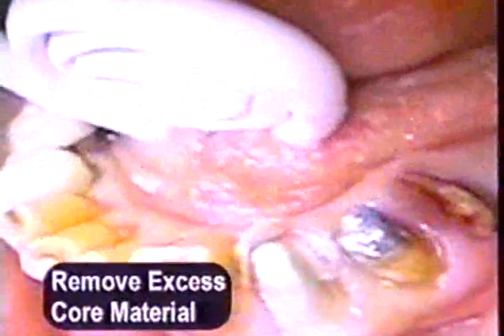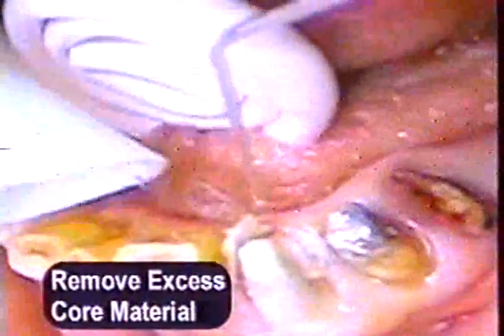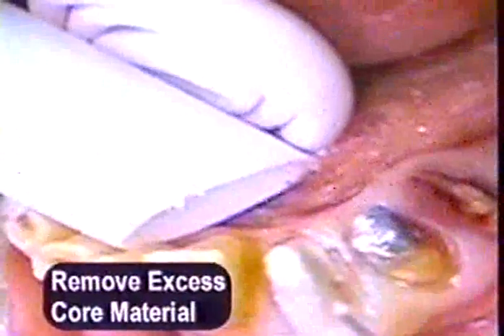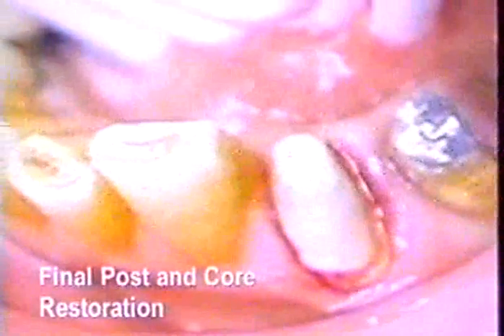The bridge is taken off and the excess core material in the sulcus is carefully removed. Excess core material on the core can now be ground off. The access post and core restoration is now complete. It can be incorporated immediately in the final treatment for the patient.